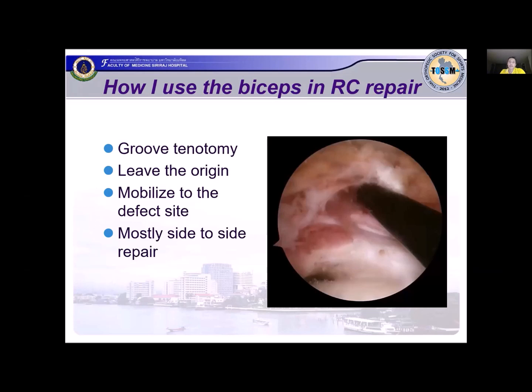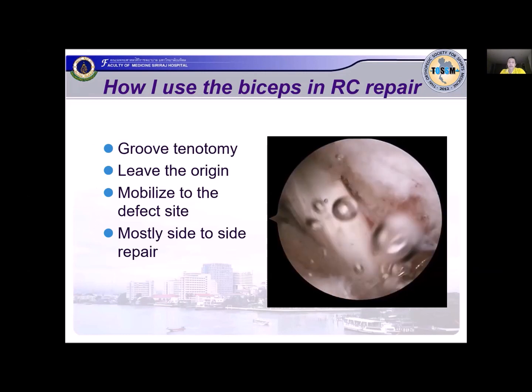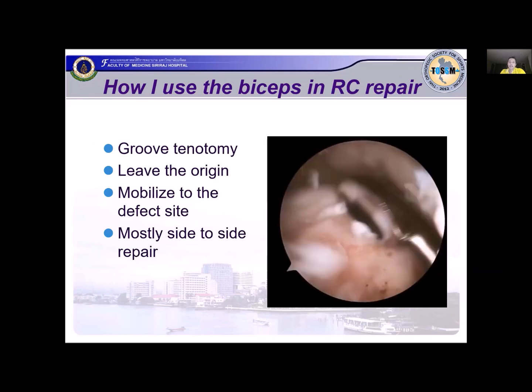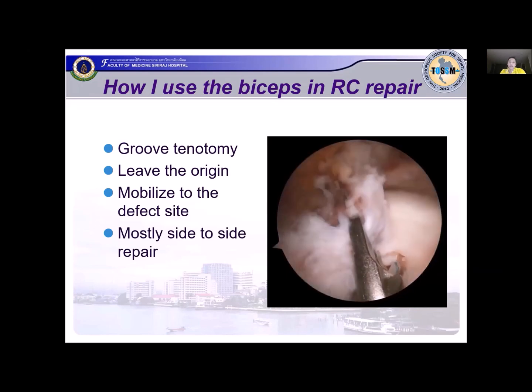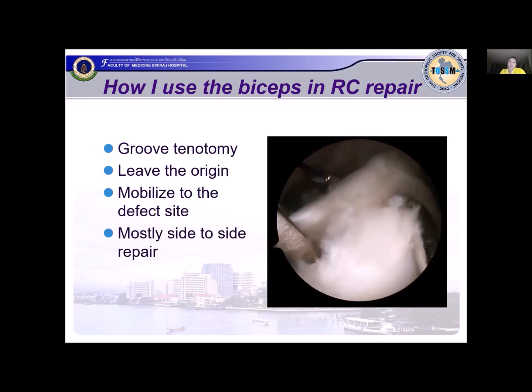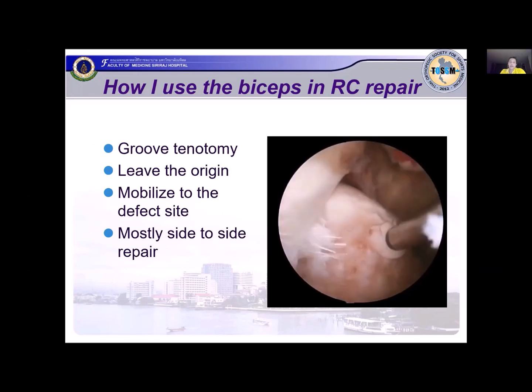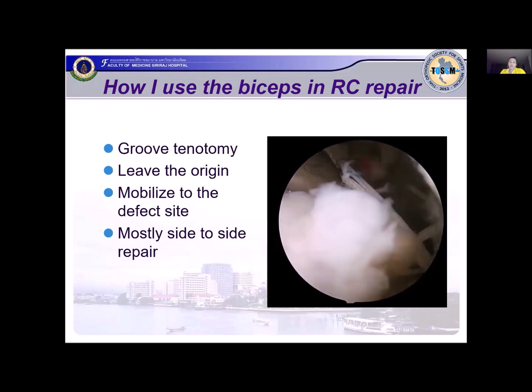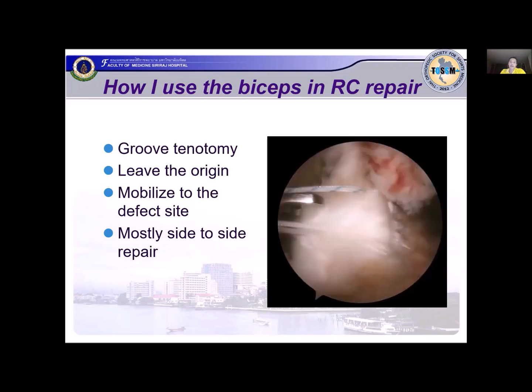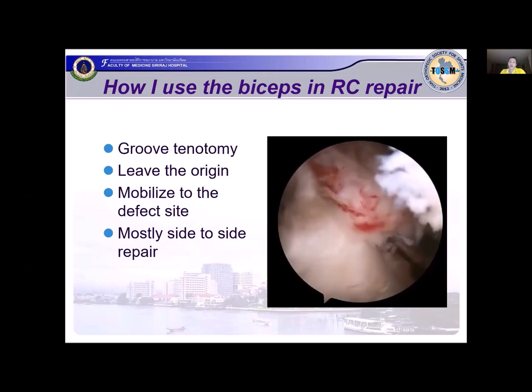This is how I use the biceps in rotator cuff repair. I do a groove tenotomy, try to pull it into the joint as much as possible, and mobilize the biceps to the mid part of the defect. I repair the infraspinatus and also repair the biceps using the same anchor. And I do the same thing in the front: I repair the biceps and also the supraspinatus. So most of the cases are a side-to-side repair, but in some cases, if you have a thick enough tendon, I think you can do a double row repair.